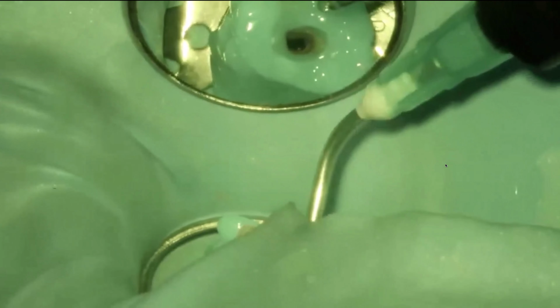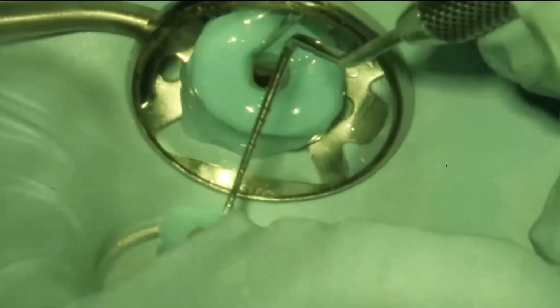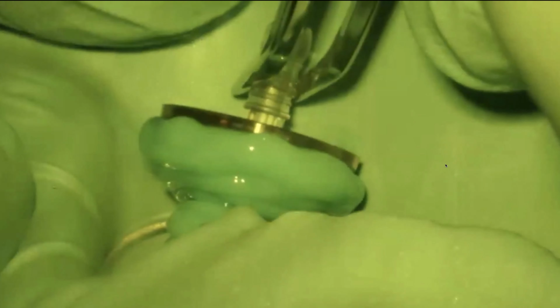Here I'm taking a perio probe and flowing it around to create a nice perfect chamber, and I'm curing. Then I'm going to add more and build it up vertically. I'm extending my access coronally here by building a second layer, like adding a donut on top of another donut. And I'm going to take my probe and make that nice and neat. I like using a perio probe here. You can use an endo plugger. You can use an endo explorer. It doesn't matter. Now, before I put the Sound Seal material on, I'm going to make sure that matrix sits nicely all the way into that channel, and it just becomes exactly like the molar. And that's it. You can polymerize multiple times.